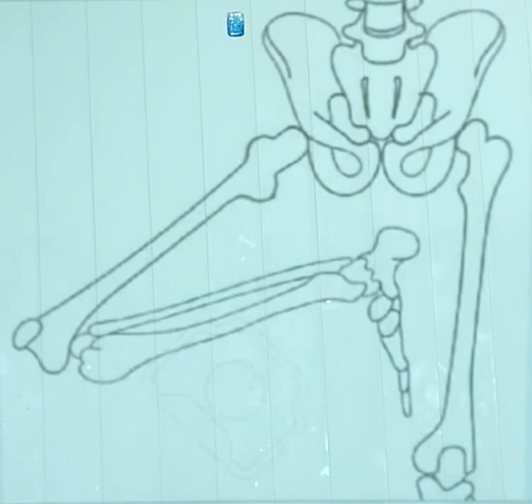You want the patient to flex the knee of the affected side and draw the foot up to the opposite side of the knee. This image does a horrible job at showing that, but this is the best image I can find. So this is what we're going to be working with. But in the real world, you want this foot to touch this knee.